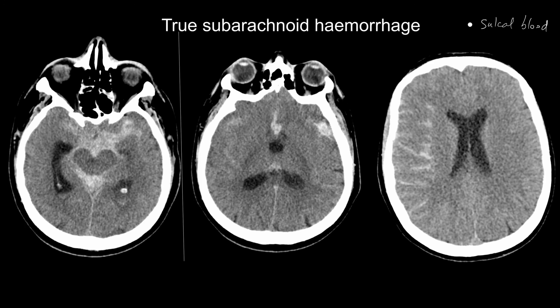True subarachnoid hemorrhage, on the other hand, tends to cause more density which is thicker around the basal cisterns, and you also get sulcal blood. This is the most important difference between true subarachnoid hemorrhage and the pseudo-subarachnoid sign. In a pseudo-subarachnoid hemorrhage you would not get the high attenuation in the sulci along the cerebral convexity.